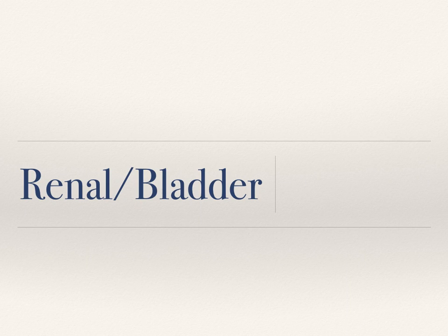This is going to be the renal and the bladder talk as well. And part of why we've included that word bladder is there's still so much pathology that we can find out from the bladder itself, whether it be from a volume status or a couple other things that you might see during your shift, whether it's with peds or adult patients.